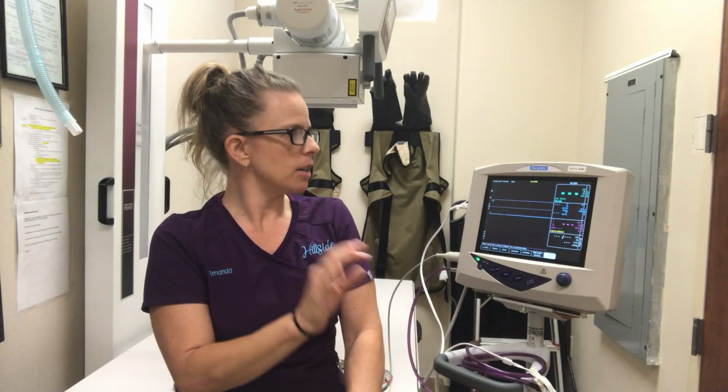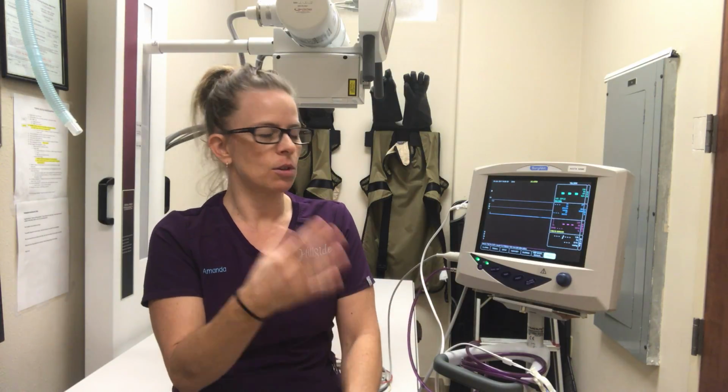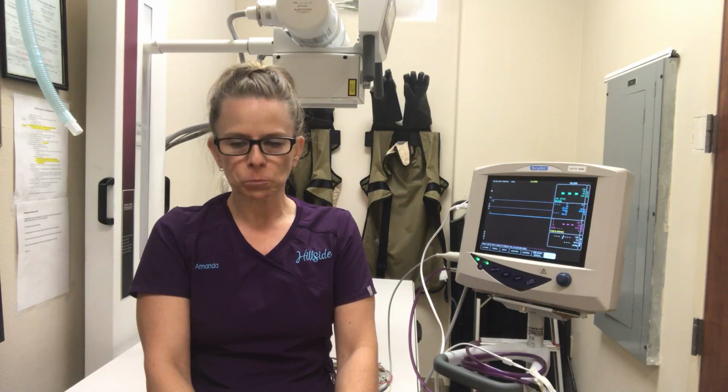You can use all of these machines, but you definitely need to just keep your eyes on your patient at all times. In addition to all of this, make sure you have a stethoscope so that you are able to listen to the heart rate manually and just make sure that everything is making sense.